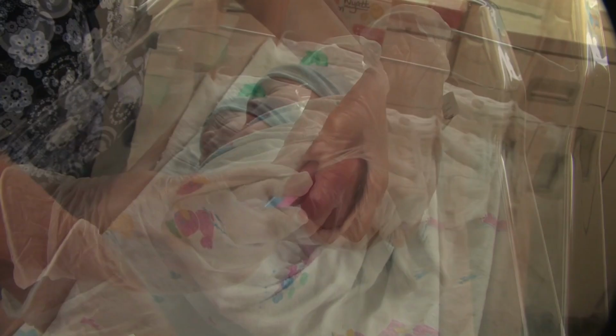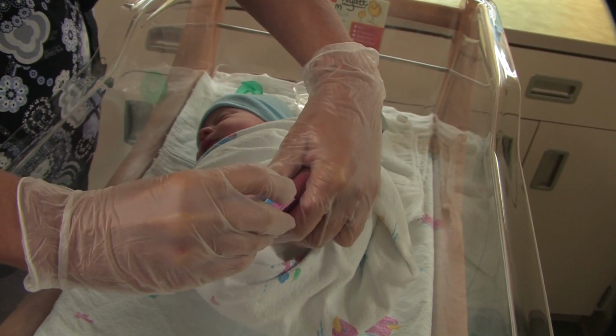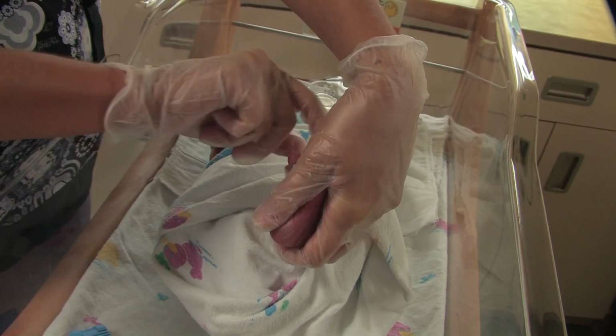Sometimes it's not possible to collect blood from the baby's heel. Can other methods be used? The heel stick is still the preferred method. It's important not to do the arch, do the ears, do the fingers on the baby, because that's too dangerous. But the heel stick is still the preferred method as long as you are not contaminating the filter paper in any way.